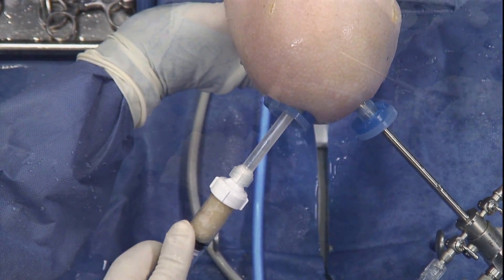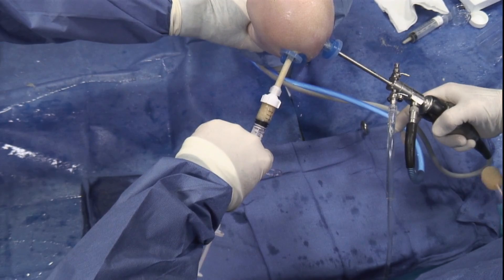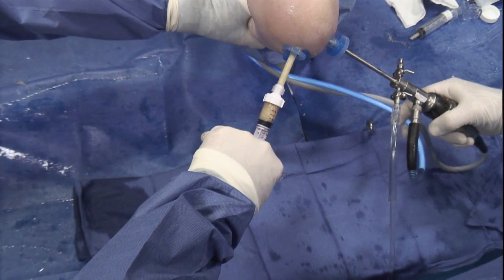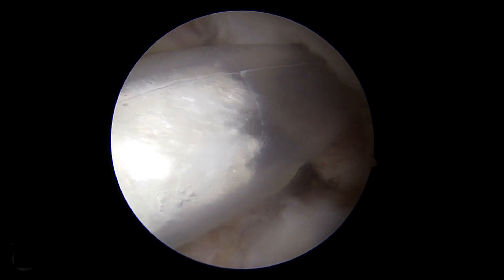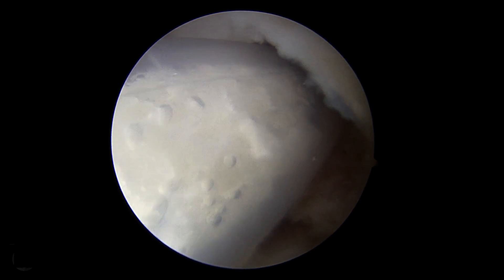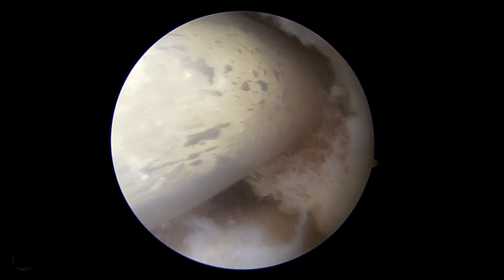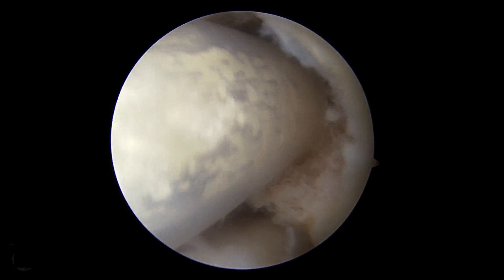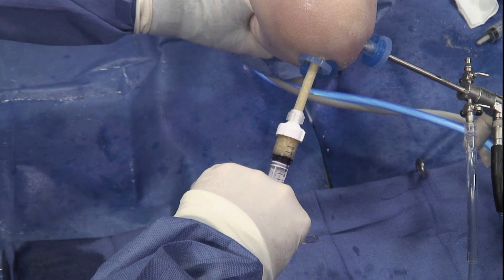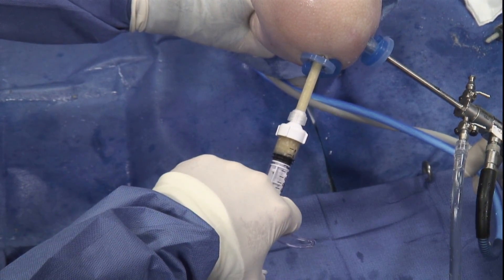The cannula is introduced into the tunnel and the large plunger is used first. You can see the DBM mixture advancing into the cannula and we'll start seeing it arthroscopically. As the bone is advanced, you gently pull the cannula back out to allow it to fill the tunnel or the defect.